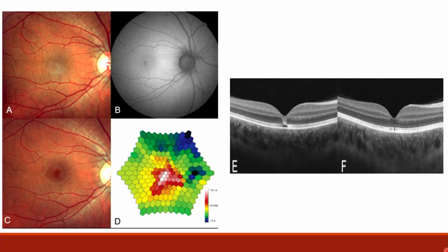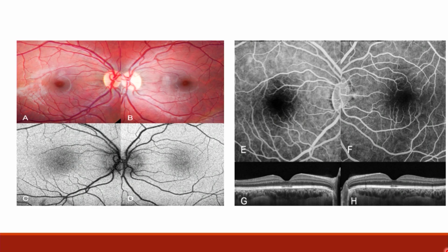And in their case, this was the patient having no problem in the RPE and the Bruch's area, while vertical, actually oblique hyperreflectivity lesions were seen just above the RPE. And this was the follow-up visit when those vertical hyperreflective oblique lesions had resolved on follow-up of 2 months. This was the other patient which was seen.